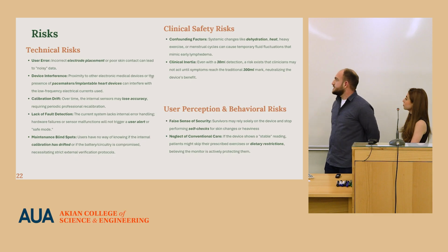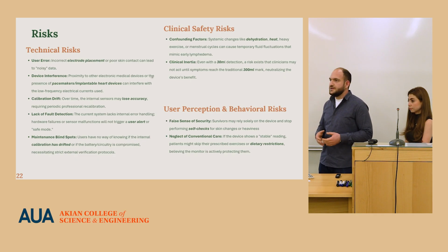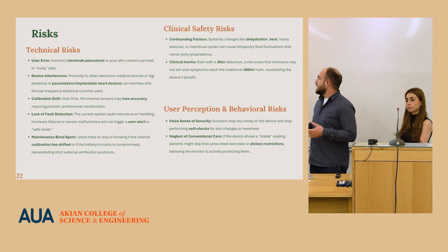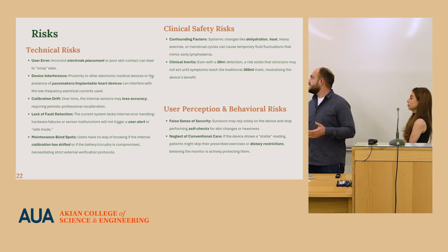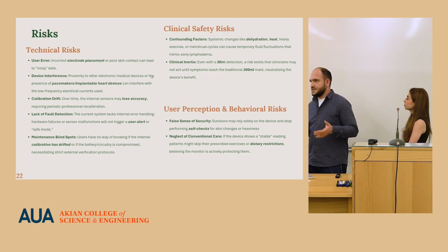We can partially fix the risk of, for example, the error handling part, because we can integrate the hardware and the software to make the device test itself every time, and if it gets some error, it indicates to the user that there is something wrong with the device, so you can't use it, or it needs calibration before using.